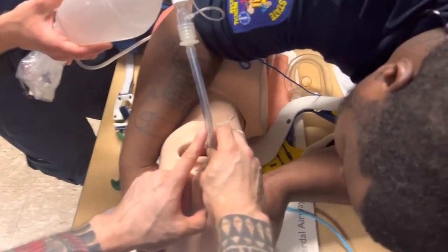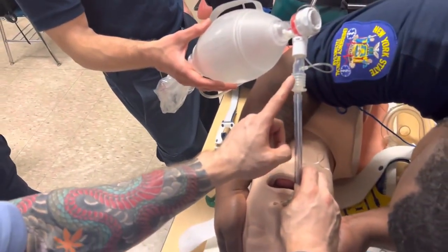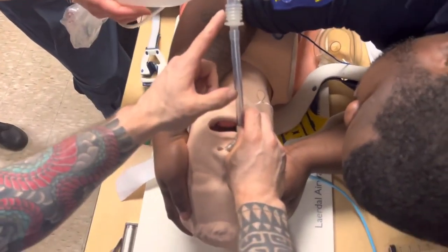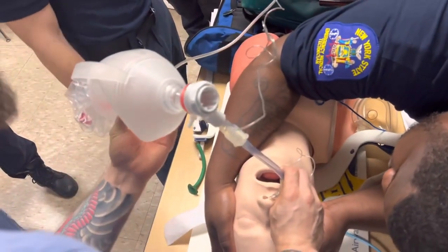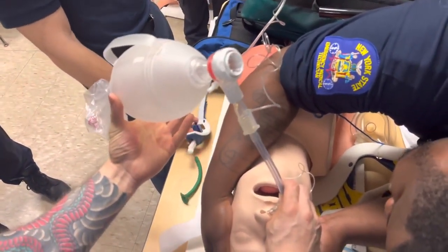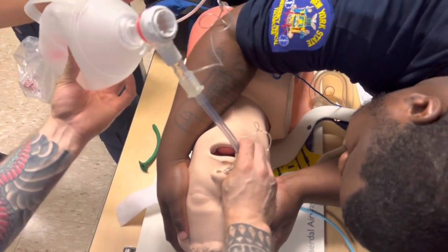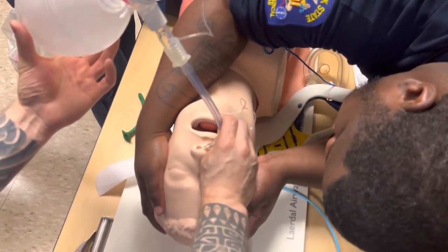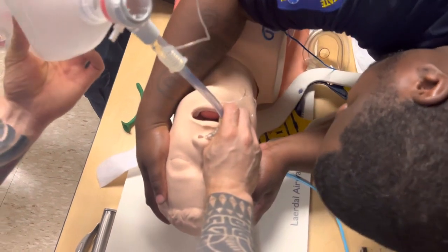And then what I'm going to do is once he starts to ventilate, I want to first get my objective data, 45, 35, or whatever the number may be. Maybe it's low, right? But this is my objective data, right? And you see expansion. So you have your stethoscope, leader, right? Where's the best place to auscultate? The stomach. And not the stomach. I never auscultate the stomach. You know why? Because I saw it go through the vocal cords. So what is the best place to auscultate?